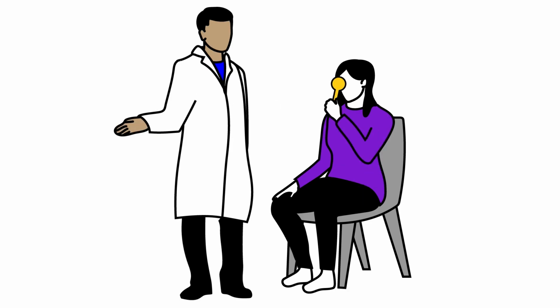One thing to keep in mind with these, and all eye exams, is that you're not trying to pass the test or reach a certain level of accuracy. The goal is to find your results. That way, any prescription or equipment your doctor suggests will work for you during your normal activities.